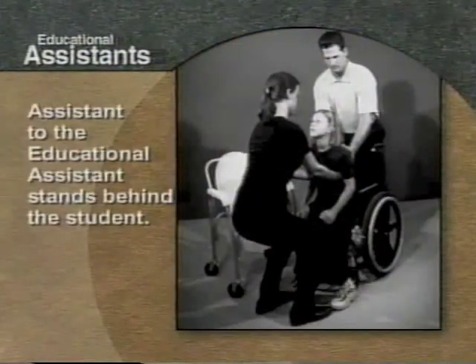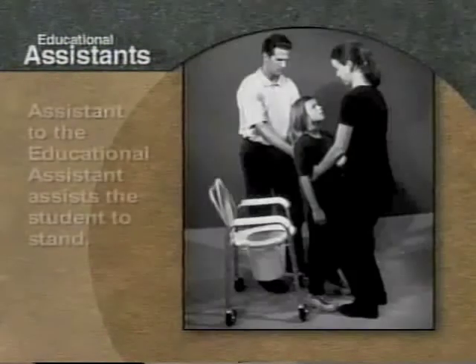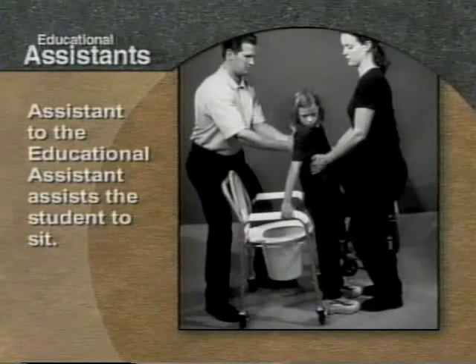Notice the assistant to the educational assistant stands between the commode and the wheelchair, behind the student. The educational assistant then grasps the student around the waist. As shown, the educational assistant assists the student to stand, and then pivots the student around and assists her to sit.